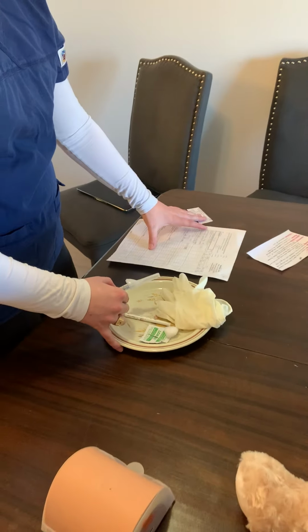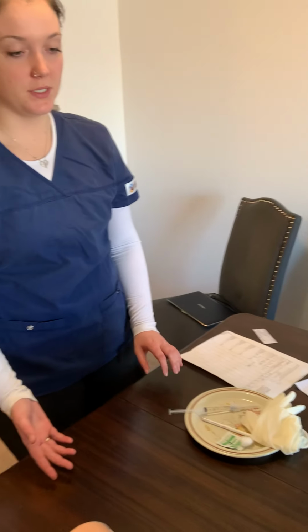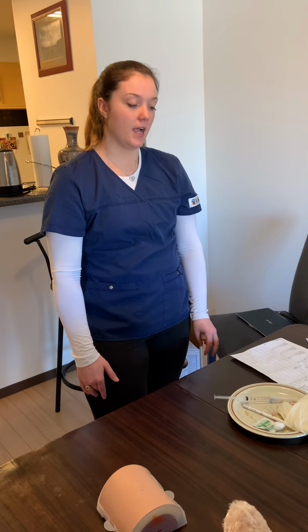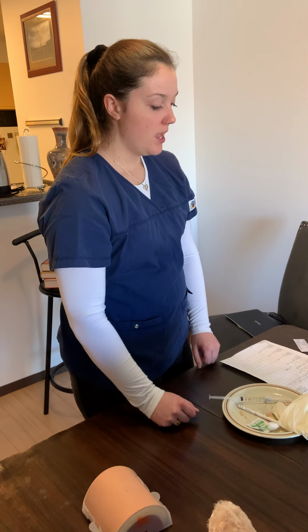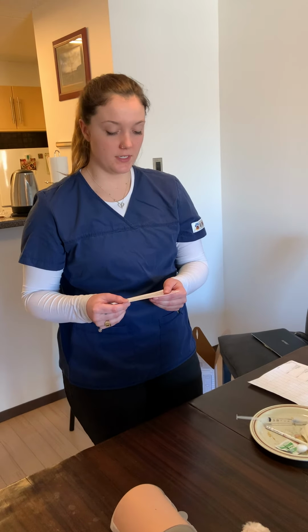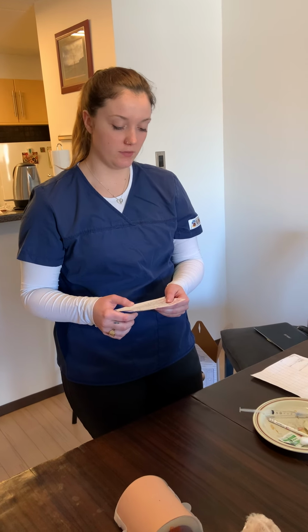Now I will tell the patient that I'm going to be giving them an injection. The needle is going to be going into their muscle, and it is for their nausea and vomiting. The drug I'm giving is ondansetron. It's an antiemetic for their nausea and vomiting due to chemotherapy and radiation.